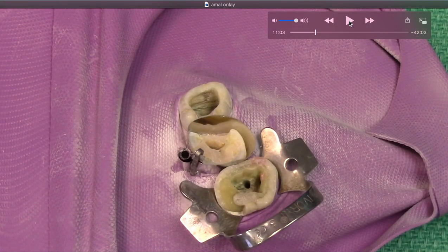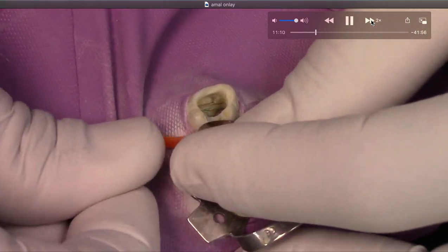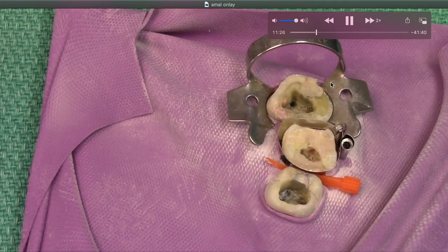Once it's tight, the clip binds it and then you lefty-loosey off. You really have to practice this — it's invaluable. I used it today, and my captain was going to use a Tofflemire wire with a little slit piece to cover the gap, but this is way, way faster. We'll place our wedge and then burnish our contact. If you haven't used these wedges on a stick, they're actually really helpful.